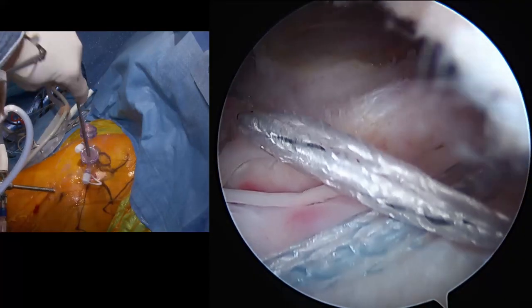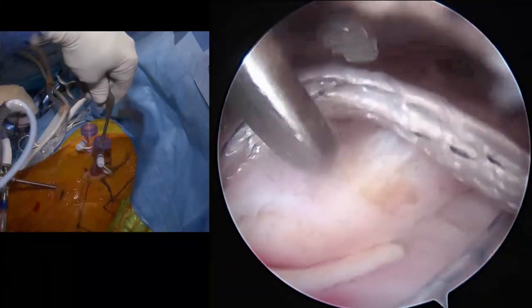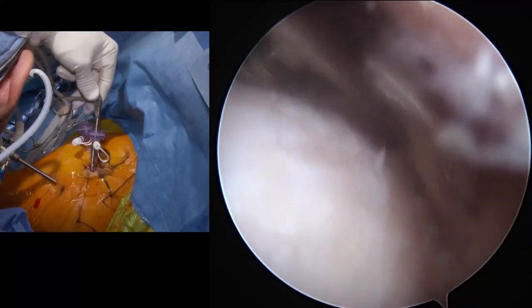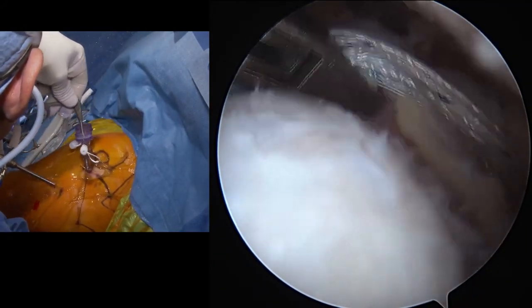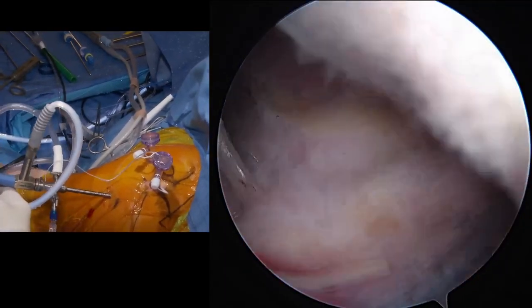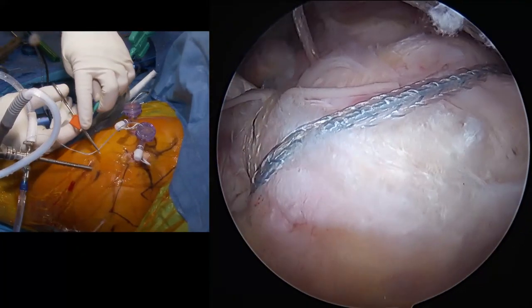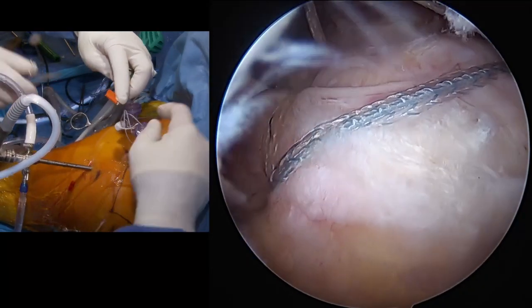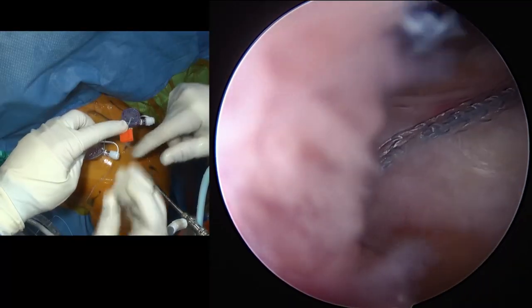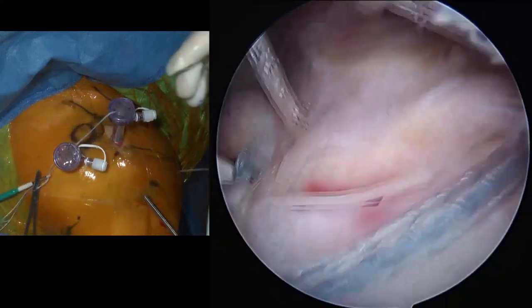And we'll get our next swivel lock anchor ready to go. Got the white, we got the other blue. We got to find him in the back again. Hiding back here. There we go. Get both those guys out. And we'll hit that corner right there, and we'll have a nice crisscross over the top of it. We'll take a punch after you get that. Oh, sorry. Thanks. Go ahead. I'm sorry. Go ahead. All right, great. And we'll take the punch now.